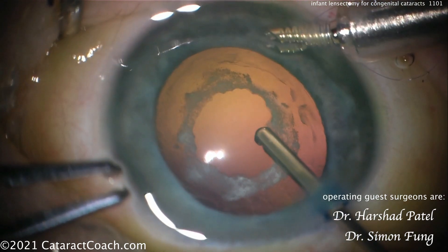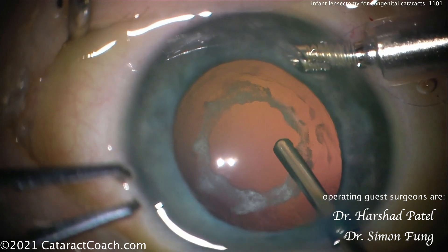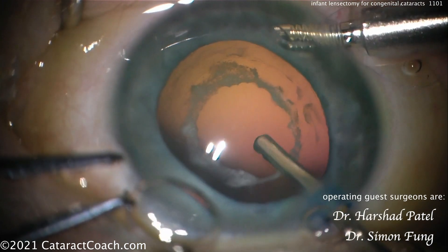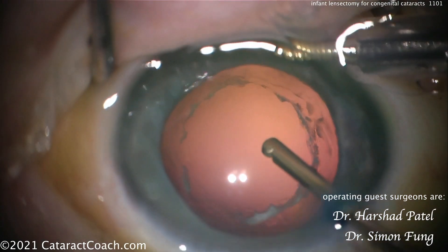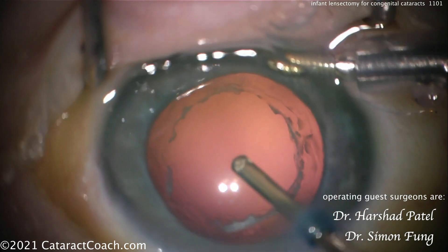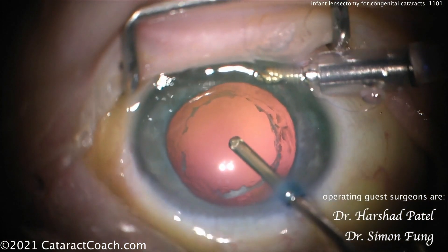We're happy to have his expertise on board. Slow and steady, removing all this material, really getting a nice opening here. Remember, you're going to end up putting an IOL here — typically in the capsule bag, or maybe with the haptics in the sulcus and the optic in the bag, or behind the rhexis opening. There are many ways of fixing a lens here, but you want something that's secure. At the end, a beautiful opening.